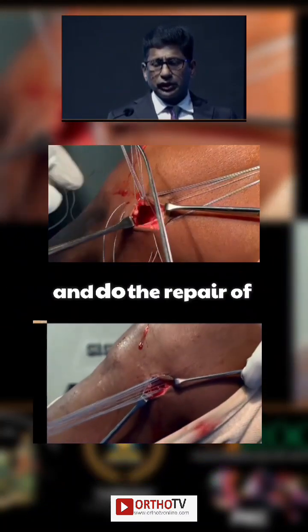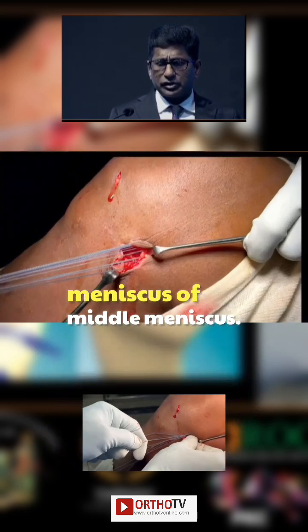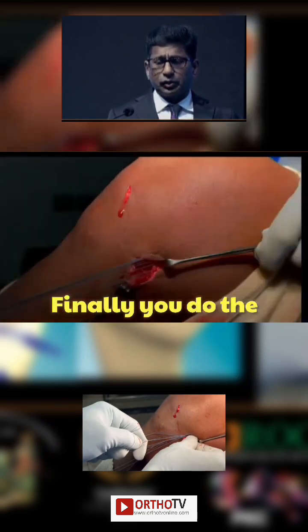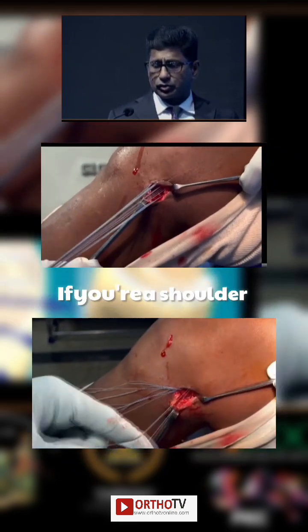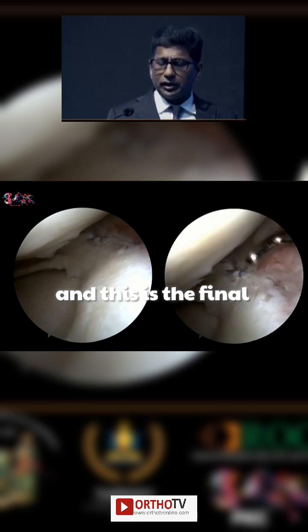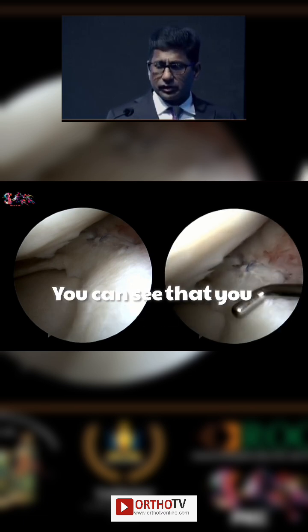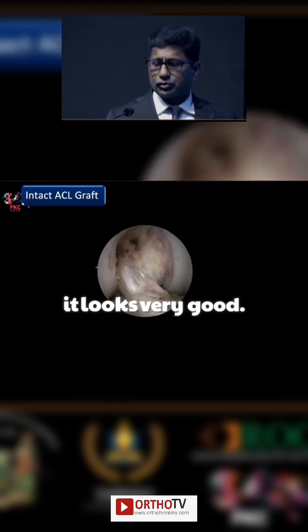This is how you take it out and do the repair of your entire meniscus — the medial meniscus. This is how you do it with inside stitches. Finally, you do the sliding knots or the simple knots — it depends upon your experience. If you are a seasoned surgeon, I tend to do a lot of sliding knots so that it adds more value. And this is the final repair of that particular meniscus. You can see that even though it looks a whole meniscus tear, but after the entire repair, it looks a robust repair — it looks very good.